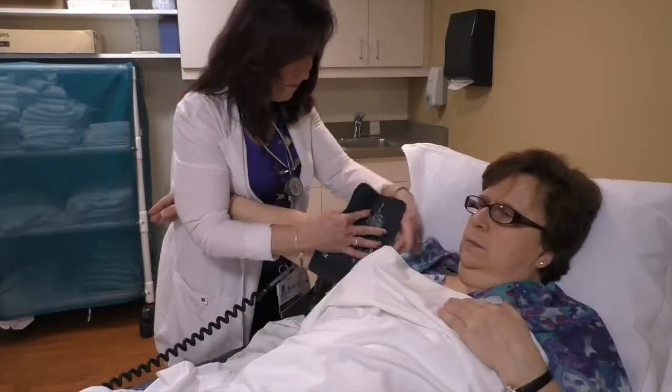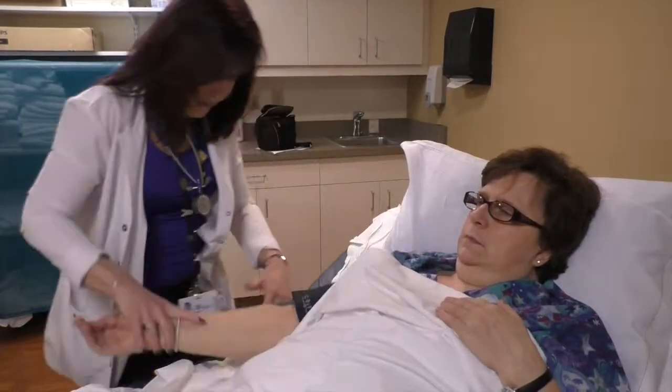Hi, my name is Robin Armstrong and I'm the supervisor of the vascular lab here at Saussure Hospital. I'm here today to demonstrate exactly how an ABI test is performed.